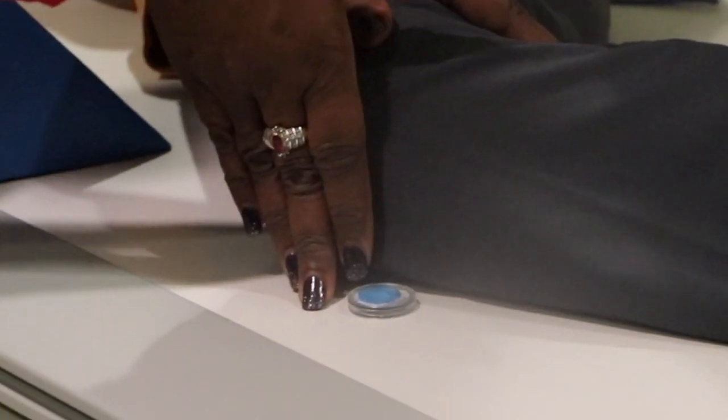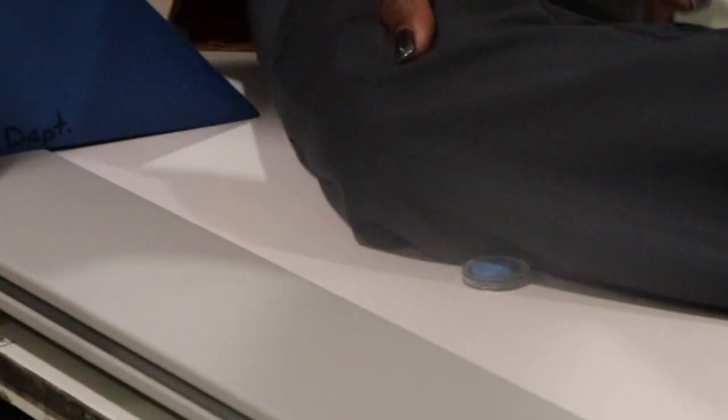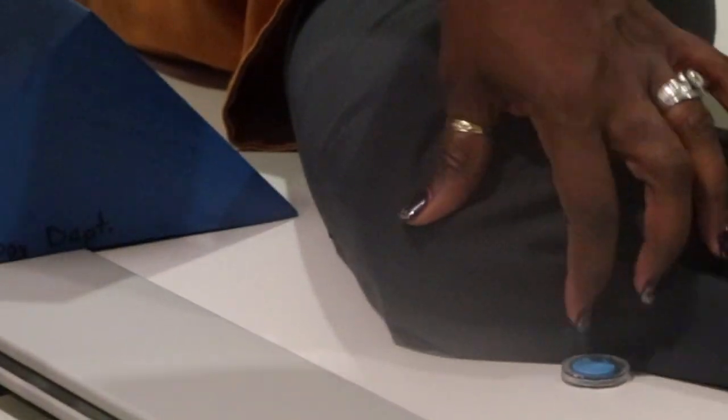So you can put the surface of your hand here. Rotate your knee down toward the table. So now it's perpendicular to the image receptor. I will move her back slightly toward the center of the table. I have a perpendicular central ray on this projection, 40 inches SID, and I put my marker right distal to the patella here.